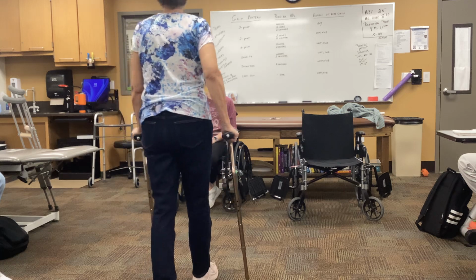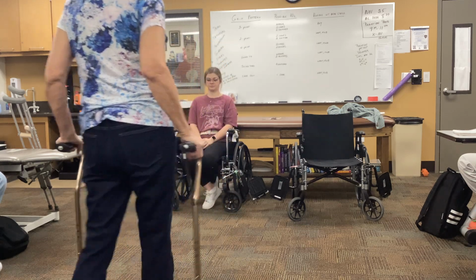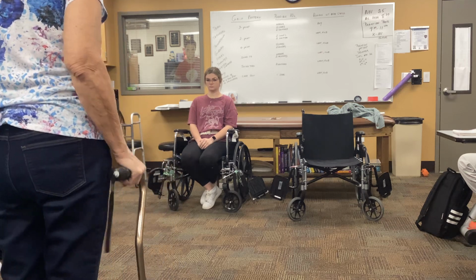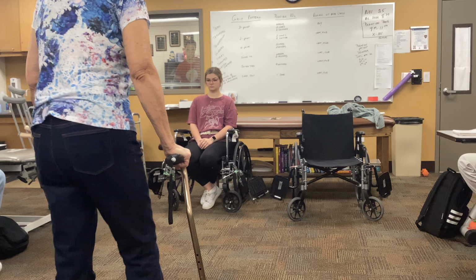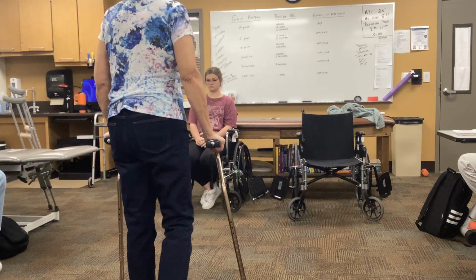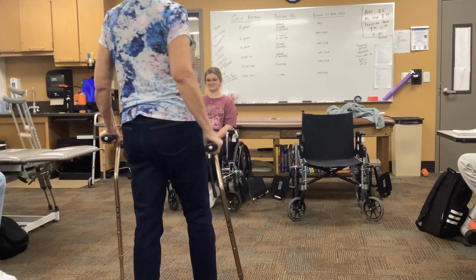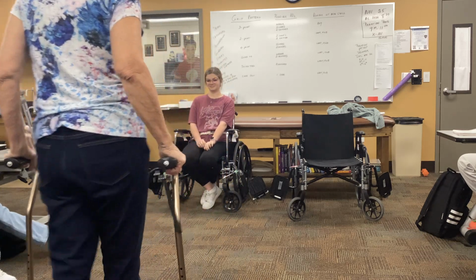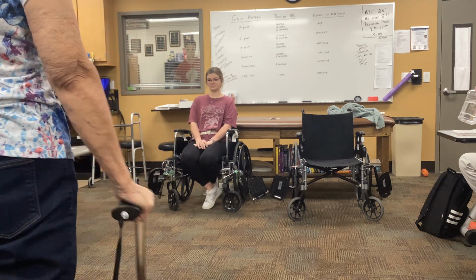Because you're trying to go faster, because you think you should. Okay. So, 4-point is each one comes down on its own. Opposite, opposite, in order to... I got myself all mixed up there. Can't talk and walk at the same time. Okay. Who uses that gait?